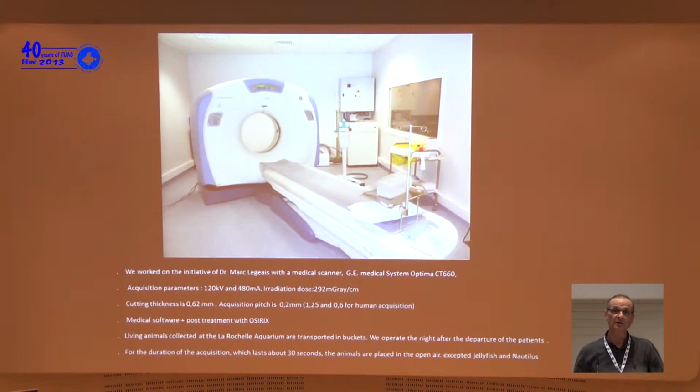Because of the ions in seawater, seawater has a certain X-ray opacity, which is why for the duration of the acquisition, which lasts about 30 seconds, the animals are placed in the open air. For some animals like nautilus or jellyfish, we kept them in water.